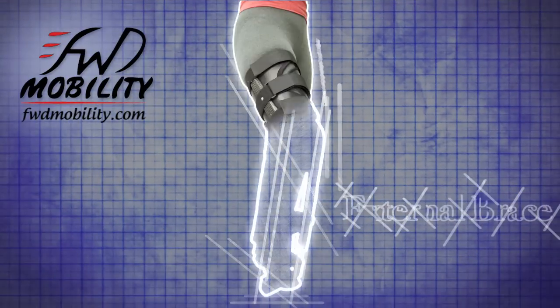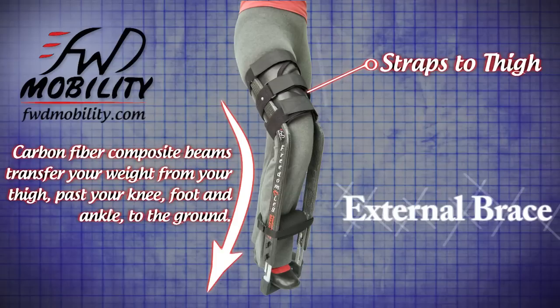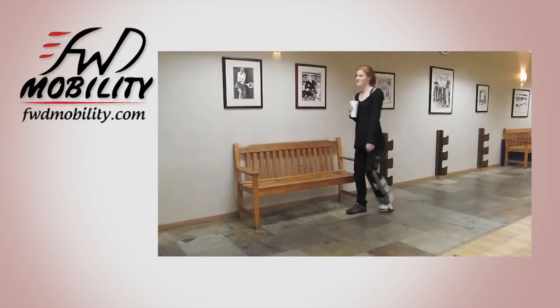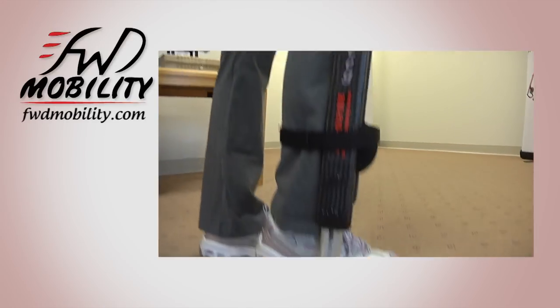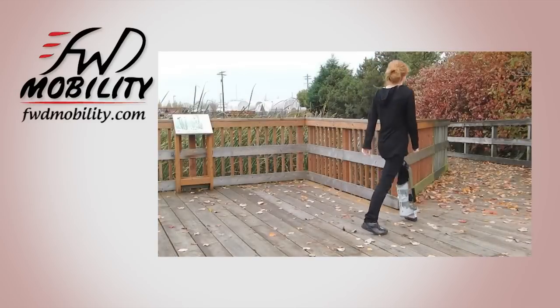The Freedom Leg is an external brace that straps to your thigh, and then with carbon fiber beams we can pass your weight from the thigh past the knee, foot or ankle down to the ground. This allows you to continue to walk, maintaining the strength in your leg while having no weight on the knee, foot or ankle. Your thigh muscles won't atrophy like they typically will while using crutches.